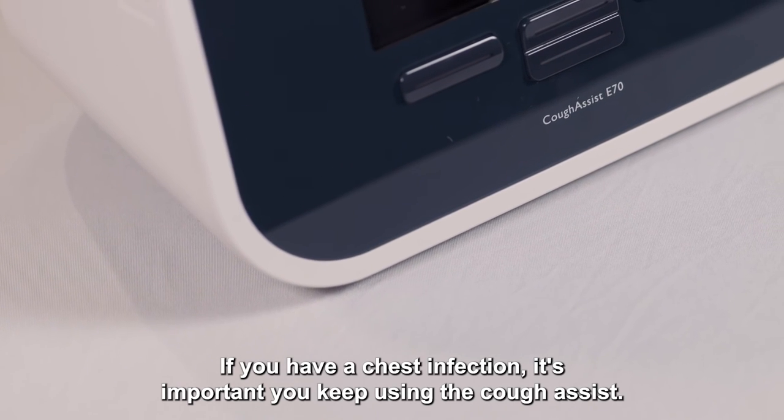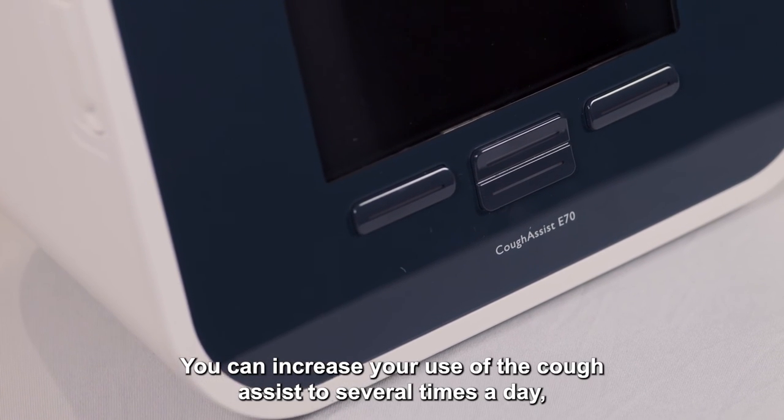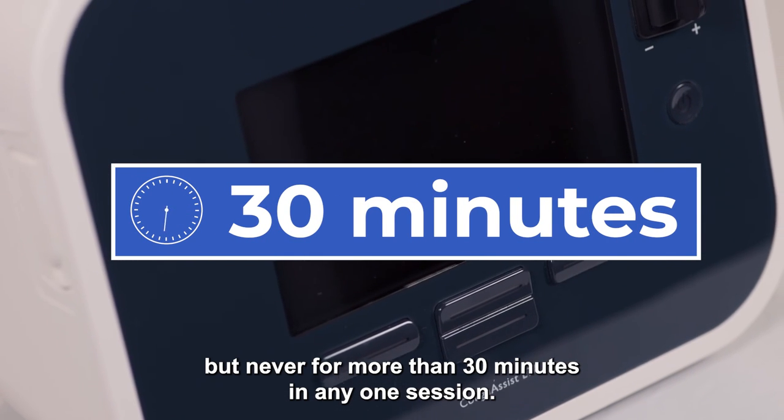If you have a chest infection, it's important you keep using the cough assist. You can increase your use of the cough assist several times a day, but never for more than 30 minutes in any one session.